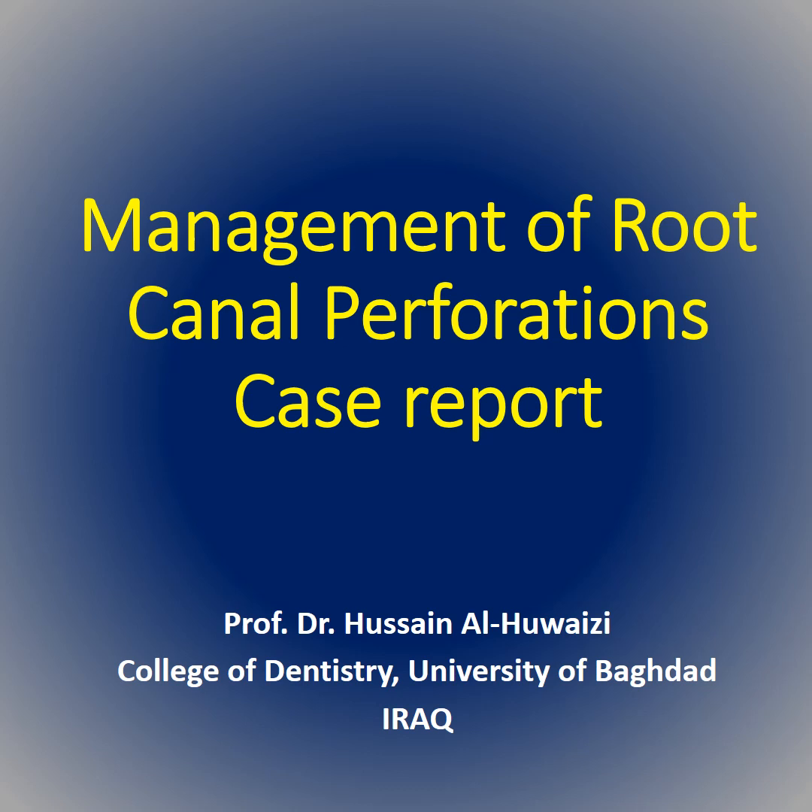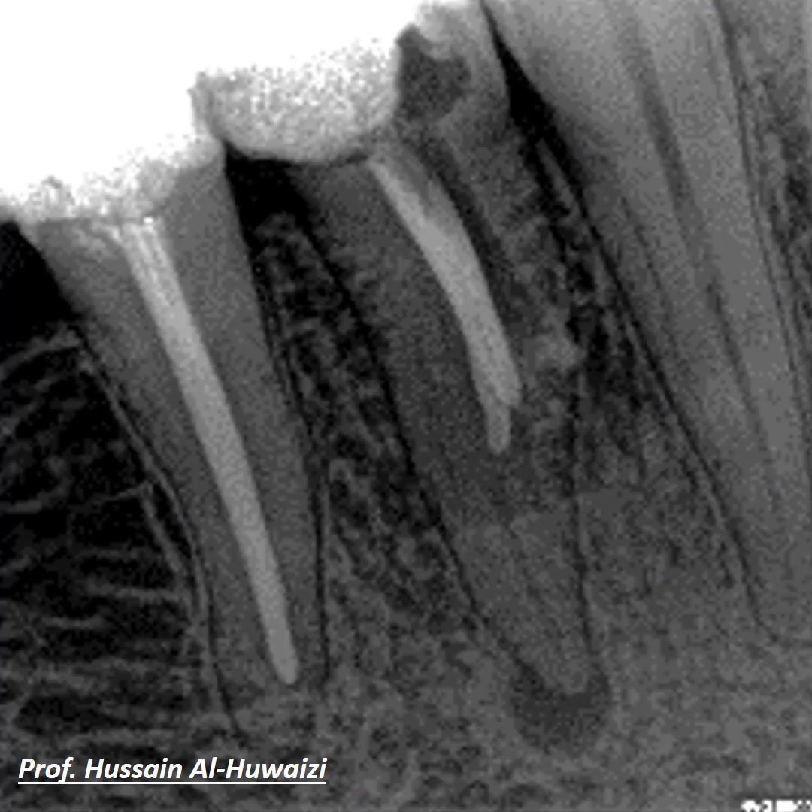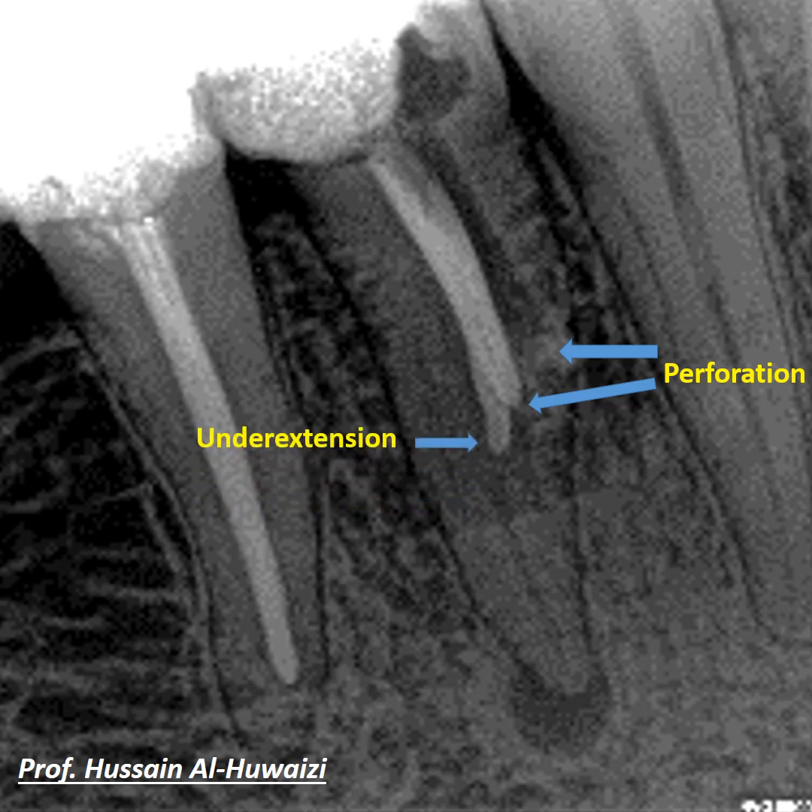This radiograph shows a premolar where the dentist did not stay within the confines of the root canal, drilling more laterally to make two perforations. One perforation was obturated while the other was left open. At the same time, the dentist did not reach the full working length for instrumentation and obturation, resulting in an under-extension of about five to six millimeters from the apical area.